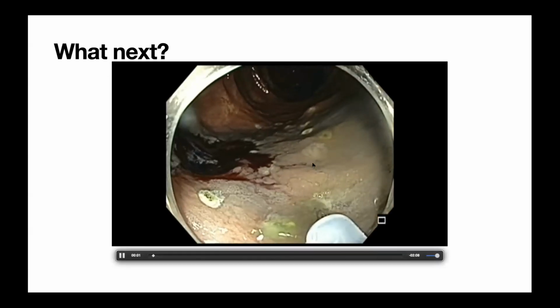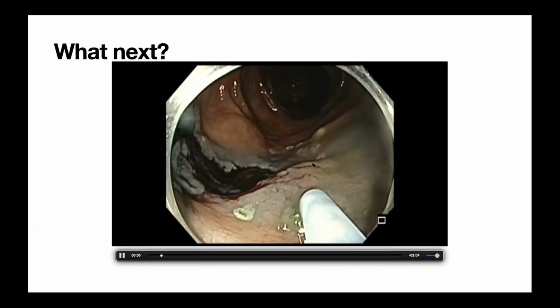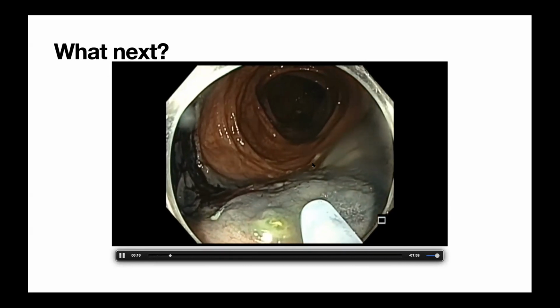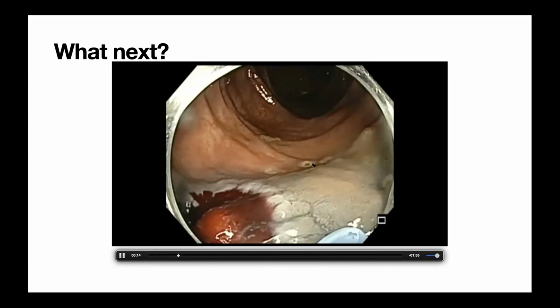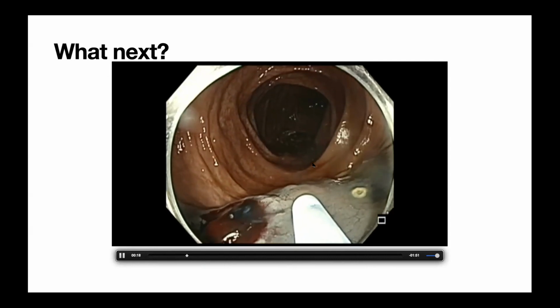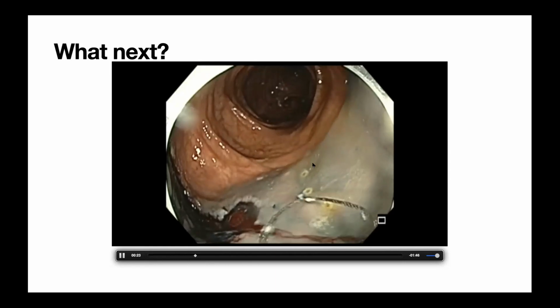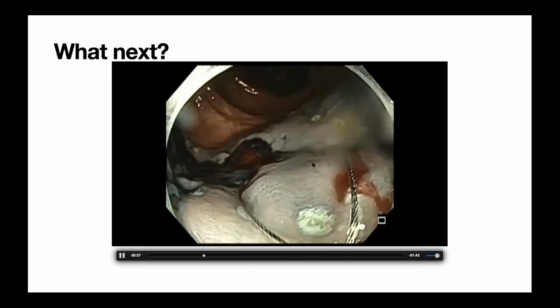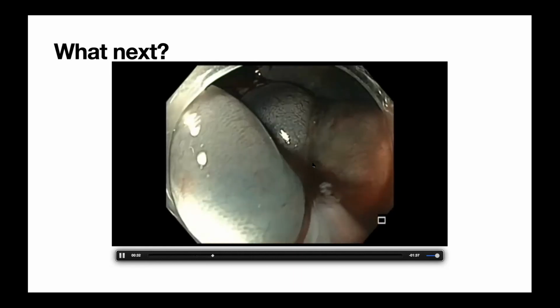So we continued the cut. Basically, you need a little bit of patience and do overlapping cuts and take time to inject and make sure that you have a good injection. Roy has nicely demonstrated last week about the use of dynamic injection technique. So it's the same thing. If you know how to inject, you can cut the polyp.